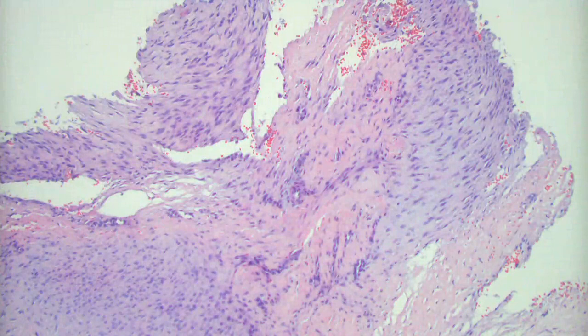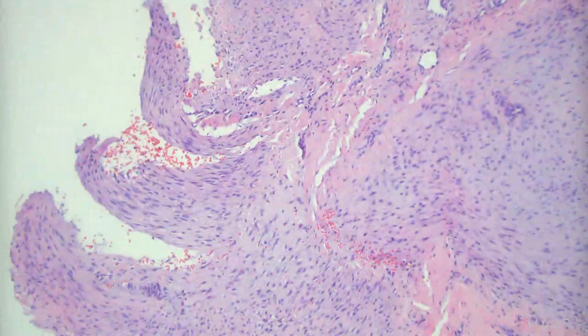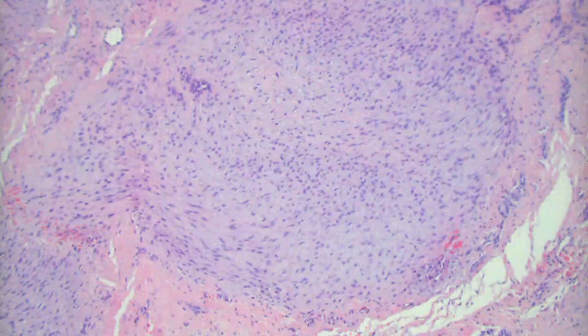Usually nodular fasciitis is more inflammatory with more myxoid stroma, it's looser, sometimes you get mitotic figures, it's also called pseudosarcomatous fasciitis. So this one really doesn't have quite that much mucin in it, and it's not all that proliferative at this stage. It's a little bit more chronic process here. It's not well circumscribed to where I would think like a fibroma. Yeah, now you're talking fibroma.